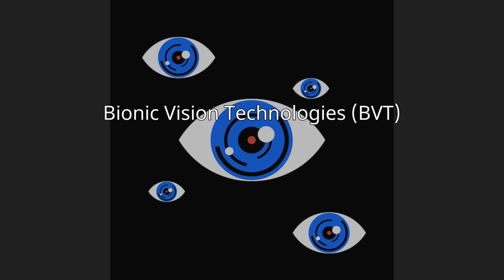While the BVA consortium was still together, the team was led by Professor Anthony Burkitt, and they were developing two retinal prostheses. One known as the wide-view device, that combined novel technologies with materials that had been successfully used in other clinical implants. This approach incorporated a microchip with 98 stimulating electrodes and aimed to provide increased mobility for patients to help them move safely in their environment. This implant would be placed in the suprachoroidal space. Researchers expected the first patient tests to begin with this device in 2013.